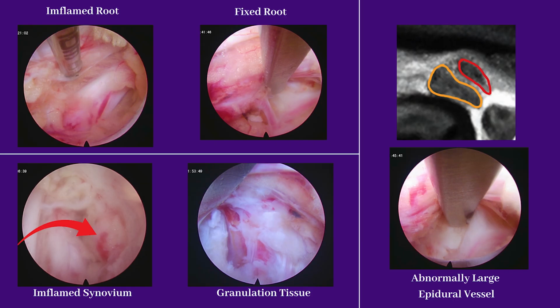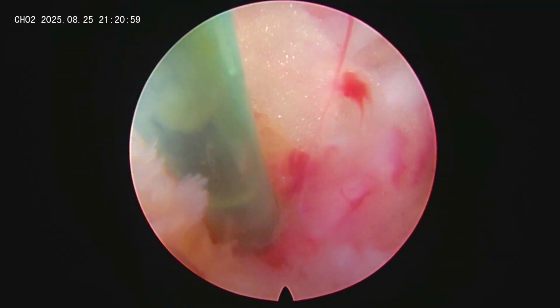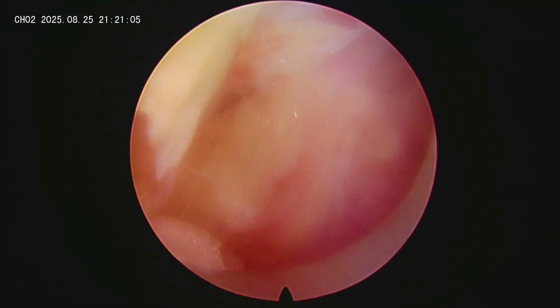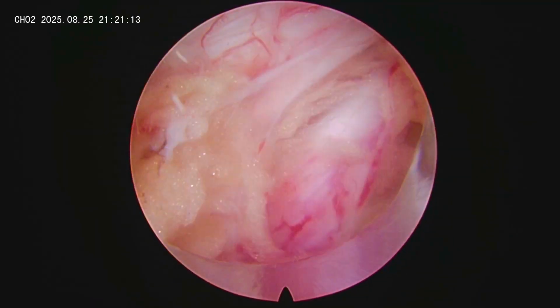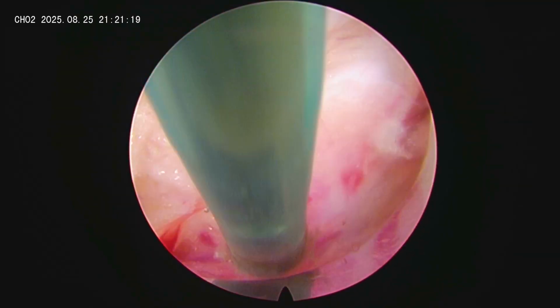During this surgery, I observed four important and somewhat unusual findings. I don't know whether these findings are attributable to the pathology or the severity of the pain, but let's discuss them one by one. This is finding number 1. This is not an unusual finding. This is one of the commonest findings when you are dealing with annular tears, where you can see the right-sided traversing nerve root is congested, swollen and hyperemic. You can also see the size of the root is increased because of the congestion only. So this is the one finding which I observed in this patient.